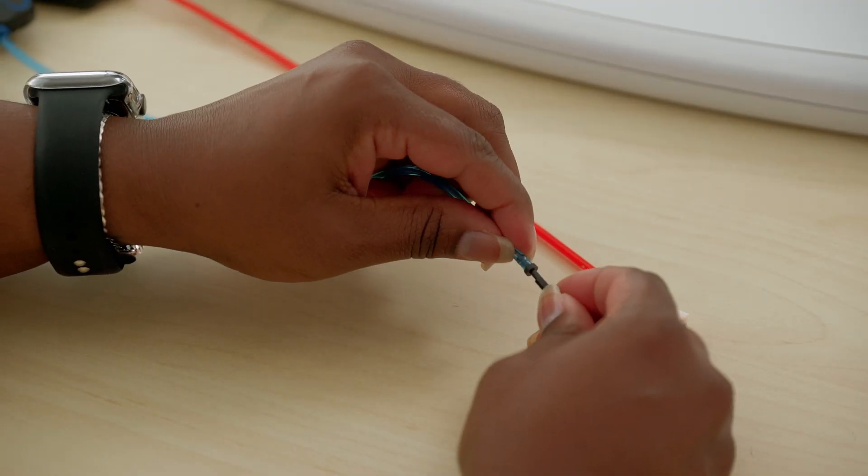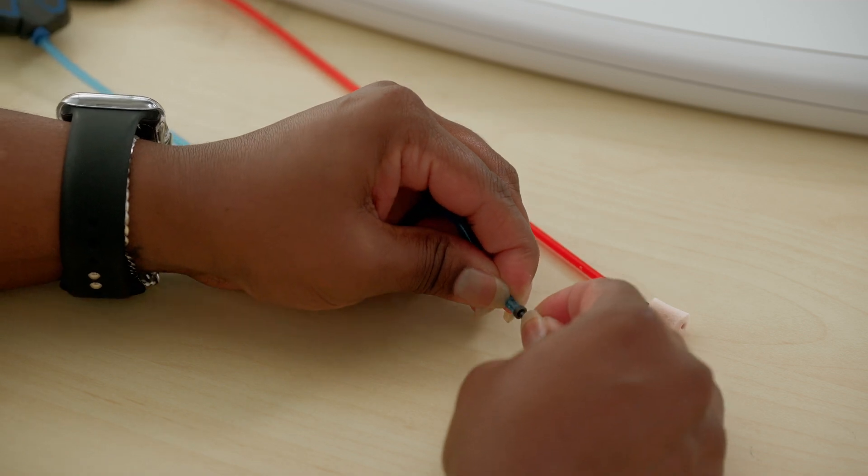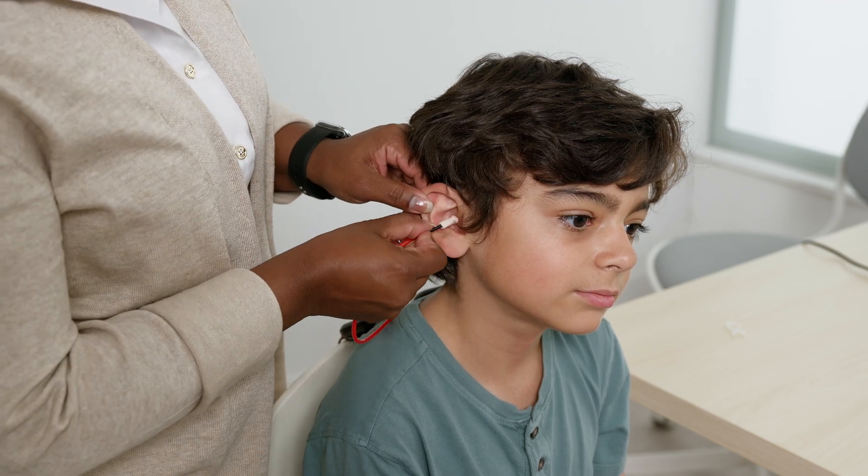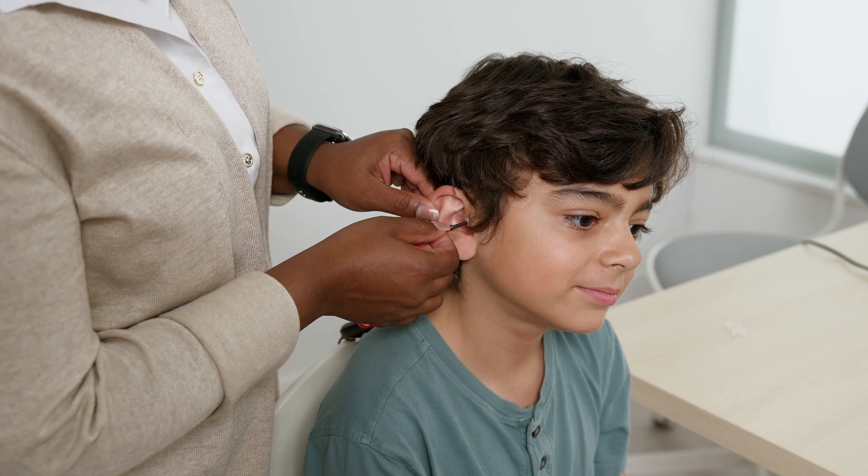For insert phones, examine the ear canals for obstruction or excessive cerumen. Place the black straw from the foam ear tip completely onto the sound tubes. Roll the foam tip into the smallest diameter possible. Pull up and out on the outer ear and insert the ear tip well into the ear canal. Make sure the right and left inserts are inserted into the correct ear. Allow the foam to expand and acoustically seal the ear canal. Discard the ear tips after a single use.